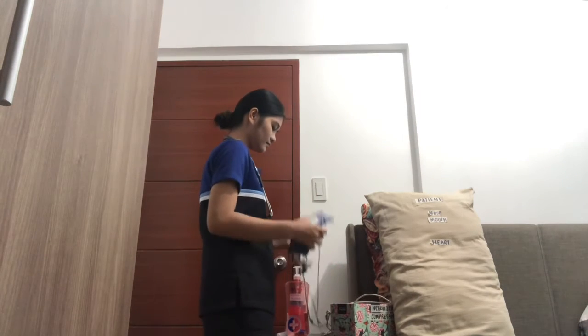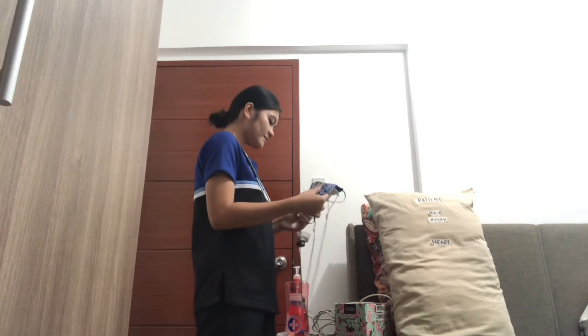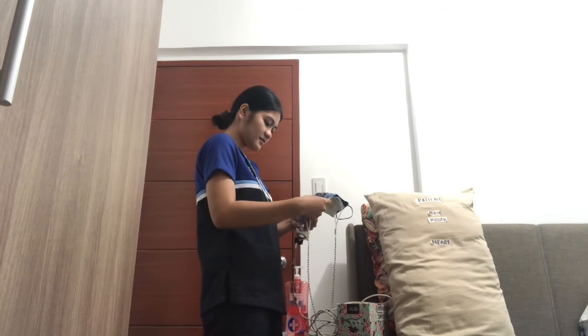Then after that, we will now put the face mask to the chamber.